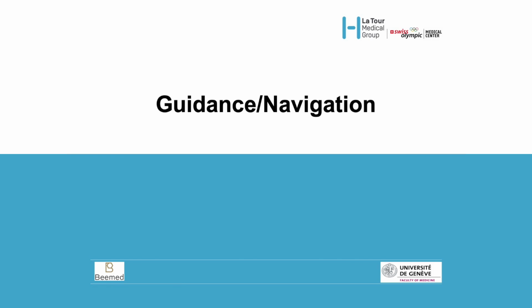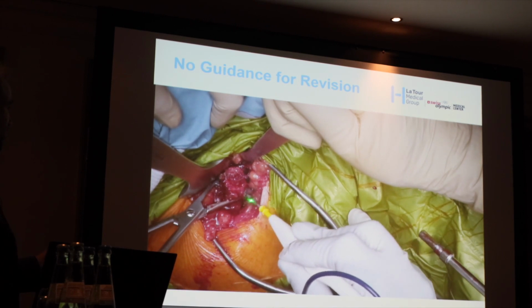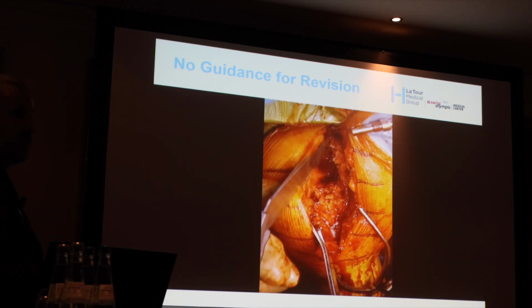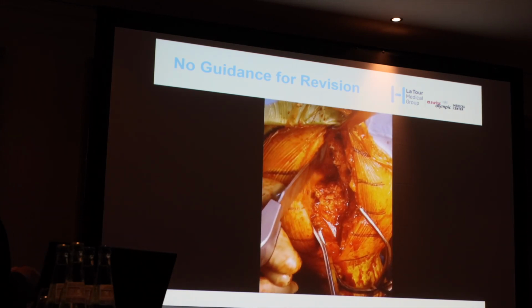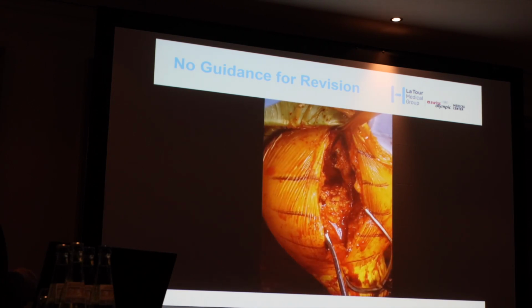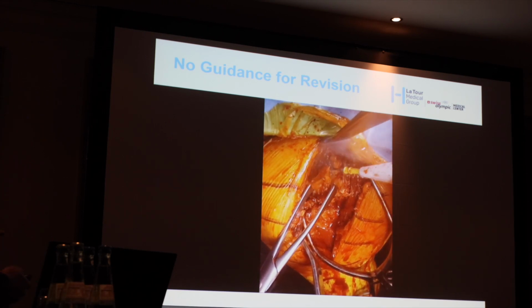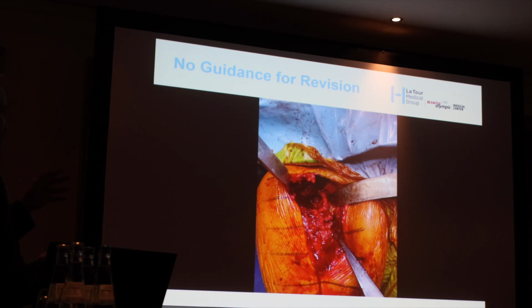But for these cases, the planning is clear, but you need what we call guidance during surgery. And it's very difficult to have guidance because today it does not exist. So I took the iliac crest, first step. And this is an article that we published with Philippe. I also took the coracoid process and tried to reconstruct the glenoid to have some bone in order to implant the glenosphere. So I took the coracoid process here. You just detach it. And then I exposed the glenoid, and you will see that it's a disaster. There is just a thin layer of bone.